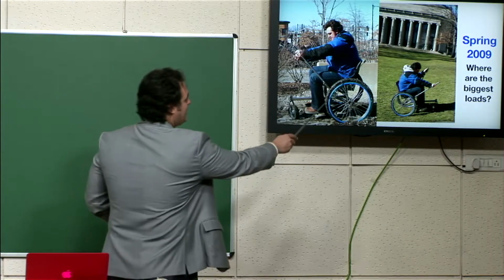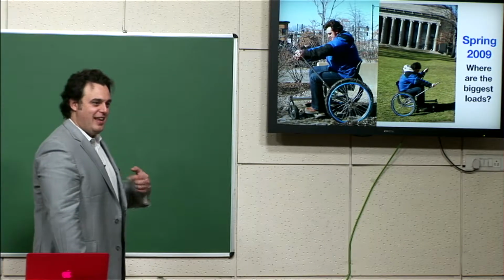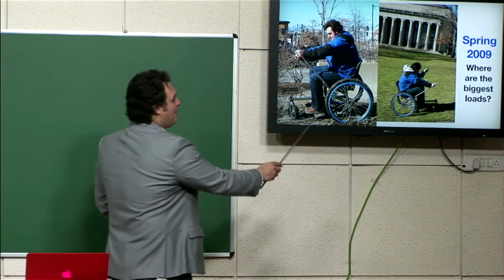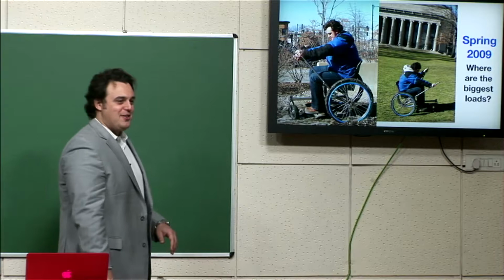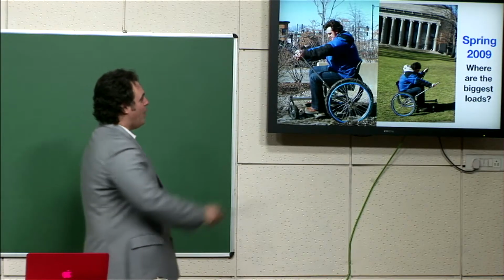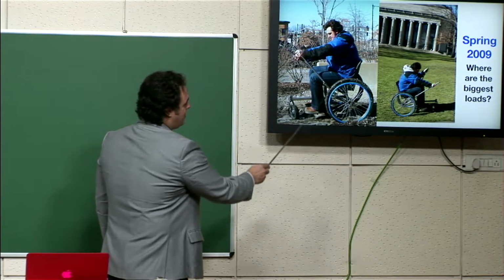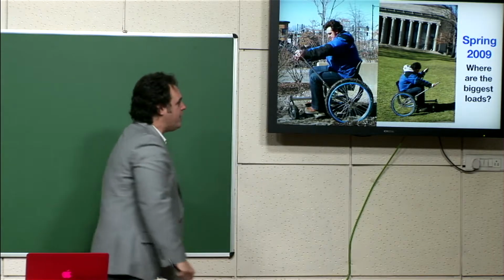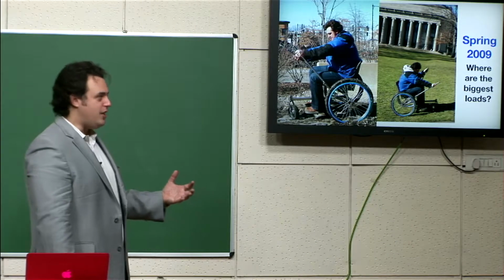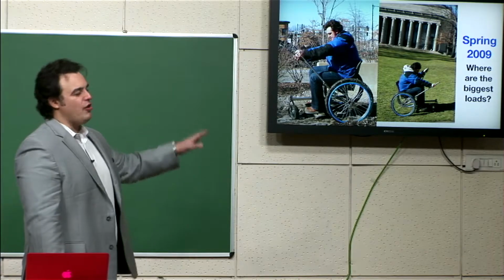It's actually a plastic seat that I stole out of my mother's workplace. In their cafeteria, in their canteen, they had these chairs with plastic seats, but a metal frame underneath that we could weld to. So I didn't really steal it. I asked her if I could take it, but I took it, and we cut the legs off, and we welded it to this relatively simple steel frame. And we had the lever drive and the chain drive here. These are some mountain bike wheels. And you can see this is capturing the essence of what became the Leverage Freedom Chair, but it's a really simple prototype, right?